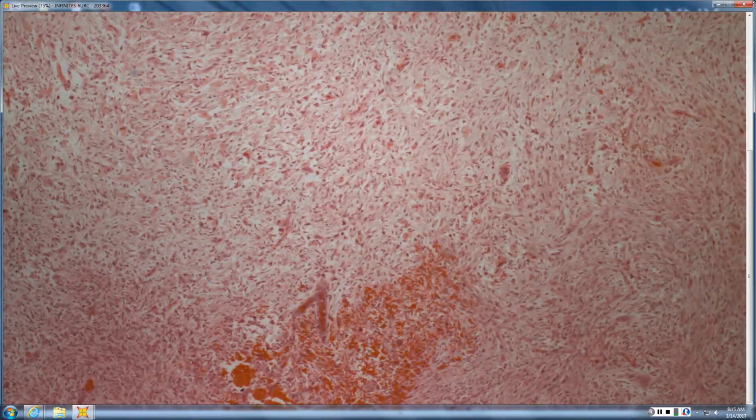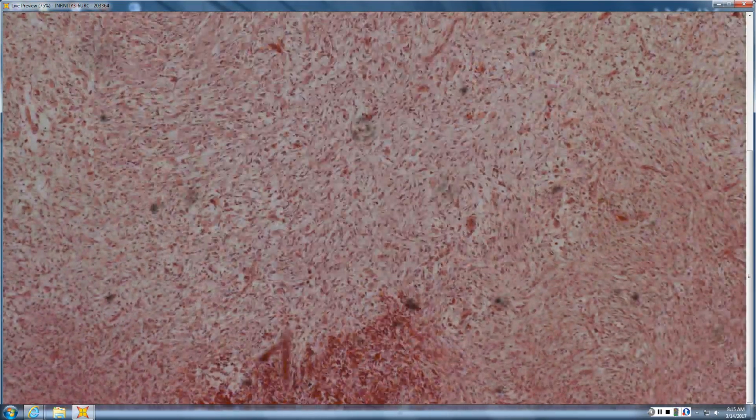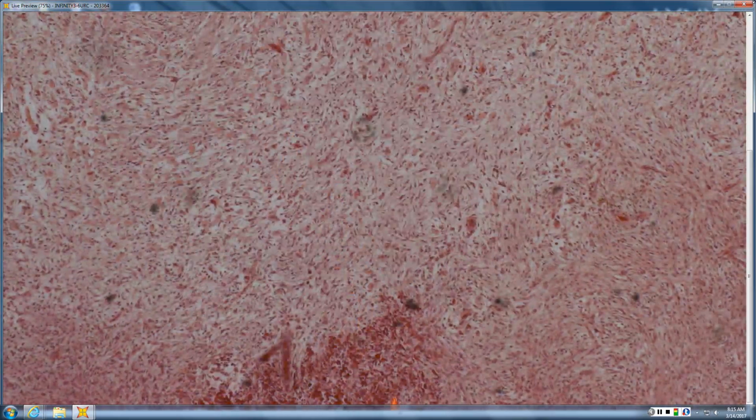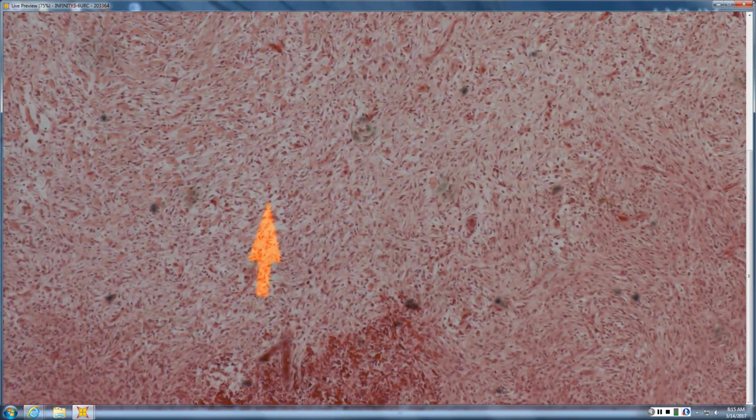I thought I saw what you saw. I think those are little blood vessels. So, you often have little blood vessels, but they're not chicken wire pattern, arborizing. They sort of radiate outward in the nodule. It's myxoid, you have red cell extravasation, you have tissue culture fibroblast appearance. That's good for nodular fasciitis. So loose, myxoid, red cell extravasation, tissue culture fibroblast, good for nodular fasciitis.